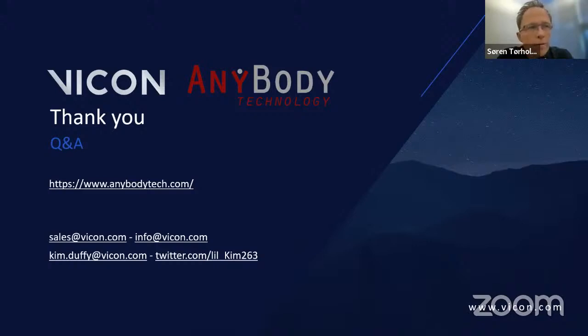It depends. You would need to cut away the part of the model that you don't have markers for, or you need to create synthetically the movement of those body parts that was not measured. And you would also need to supply the model with measured forces. So then it would not be possible to do predictive ground reaction forces, for that would require the full body motion to be recorded. So generally speaking, it's possible, but it depends on the exact situation.